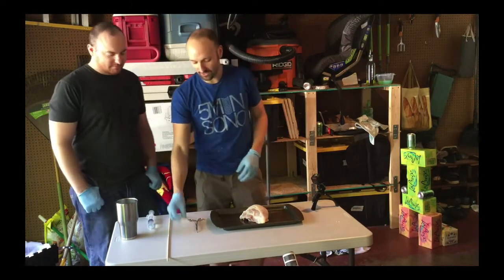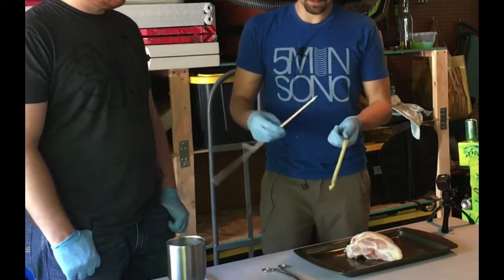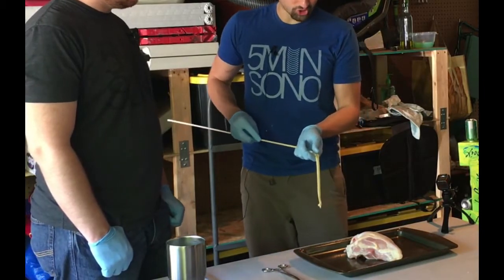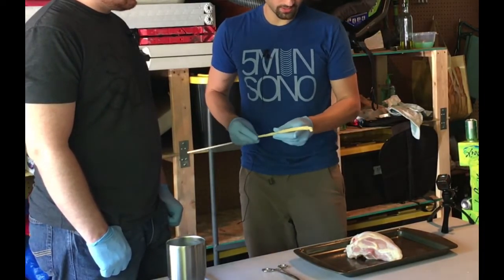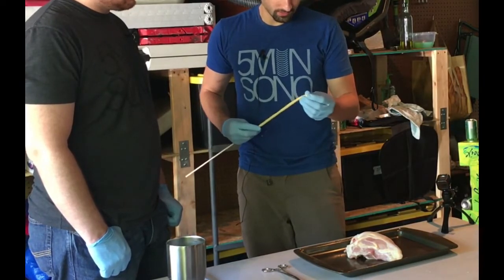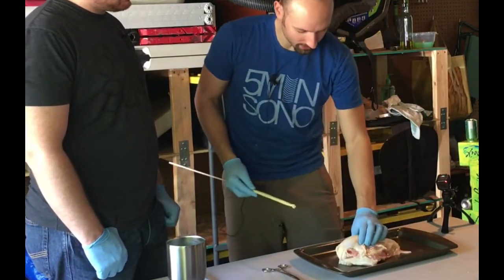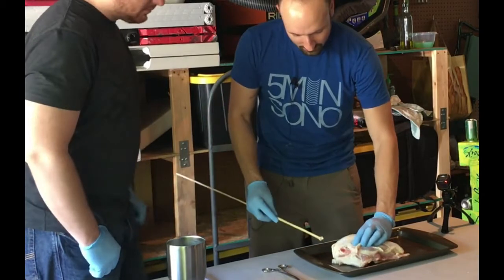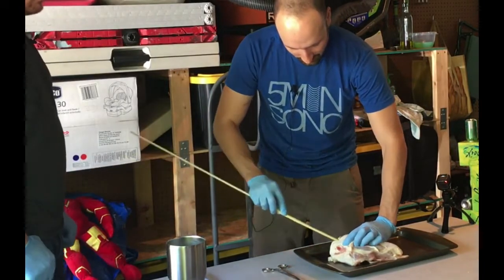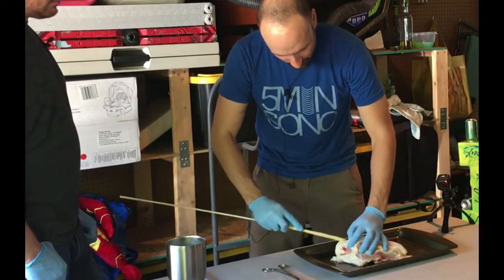So the first step is you're going to get your latex tubing. You're going to tie a knot at the end of it — that we've already done. And then you get your skewer sharpened in and gently go through this whole thing until you get to the knot. Then you find an area on the chicken breast that has the most meat — right now it's probably this right here, just a good portion of the meat — and you just introduce it in here. Make sure the knot gets in there.